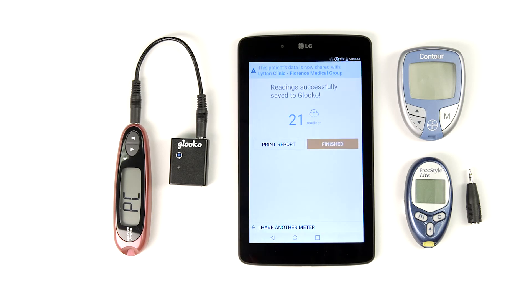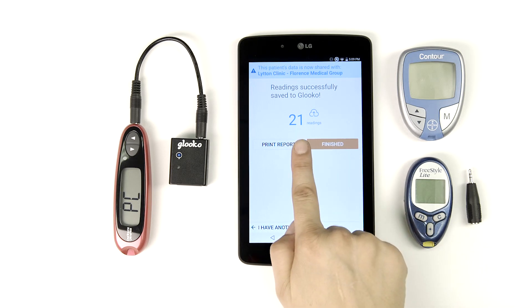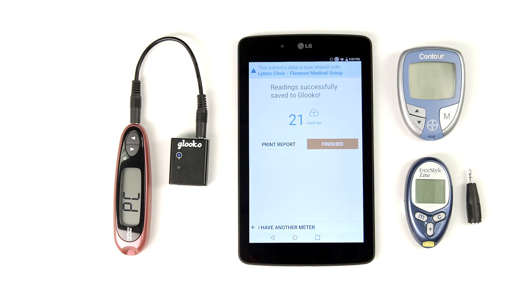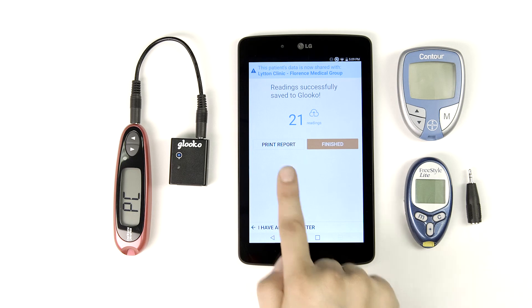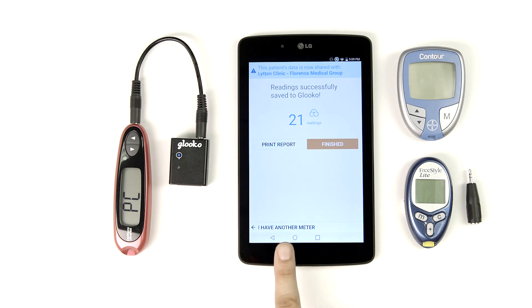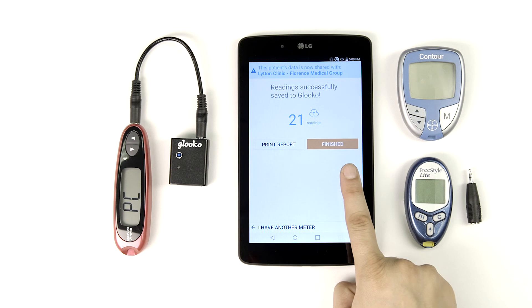The final screen of Gluco Kiosk provides the total number of data points downloaded during the sync. From here, you have several options. You may choose to print a report of the patient's data with your wireless printer, sync another device for this patient, or tap Finish to move on to the next patient on your schedule.